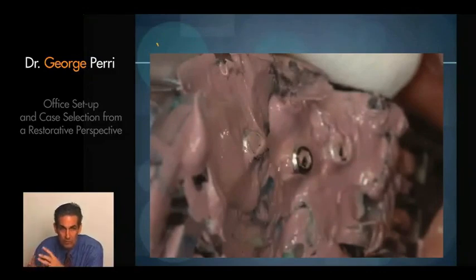So I strongly suggest that you find your own technique for achieving predictability of the master model, and when you do that, implant dentistry becomes easy and predictable and will give you the results that you want to have.